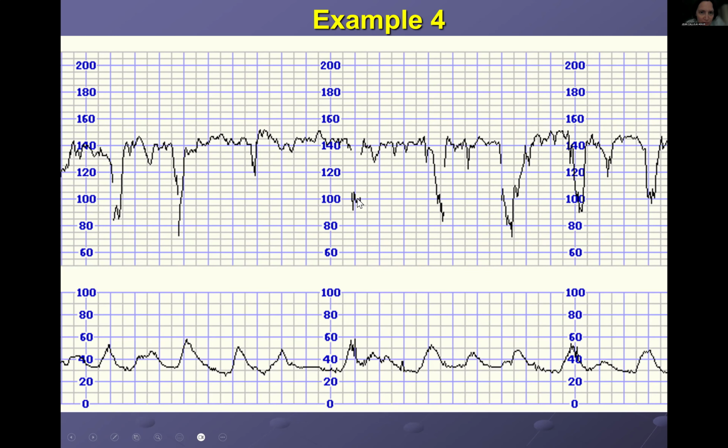Here we can't really know what's happening, but if it's there, it's between early and late. And this one here is also late. This one here seems to be corresponding. And this one here is just a little bit off peak. And this one has an early, and this one is early.